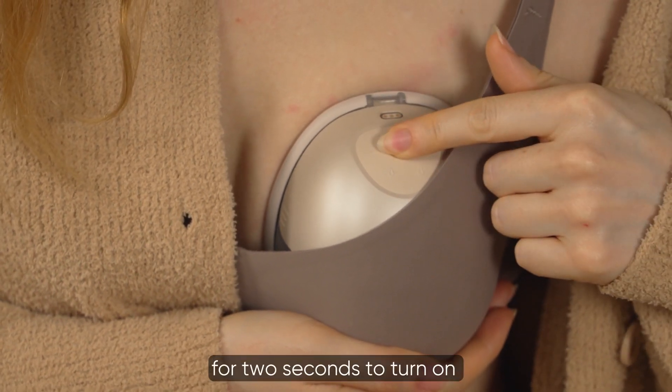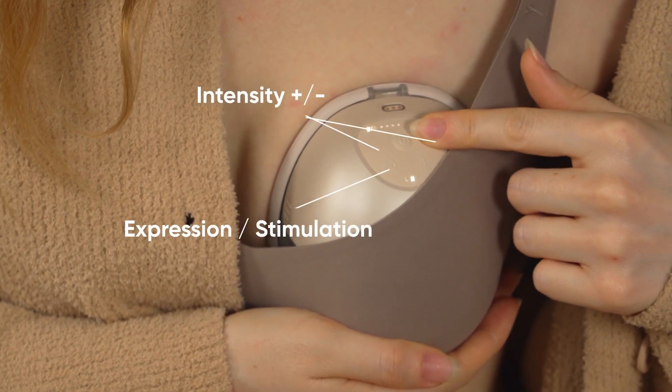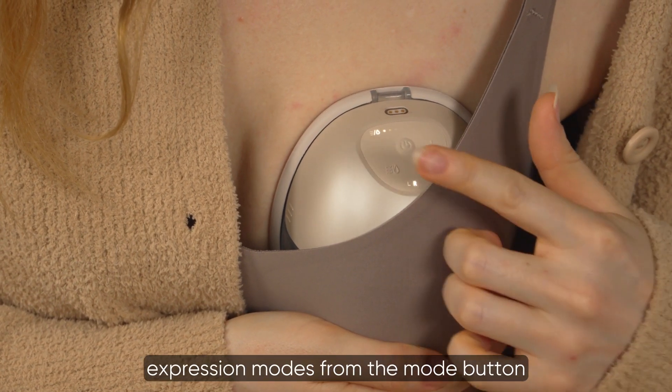Press and hold the power button for two seconds to turn on or turn off the breast pump. You can adjust intensity with the plus and minus buttons and toggle between stimulation and expression modes from the mode button.